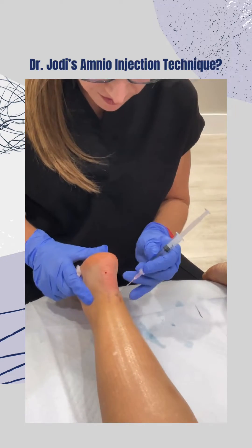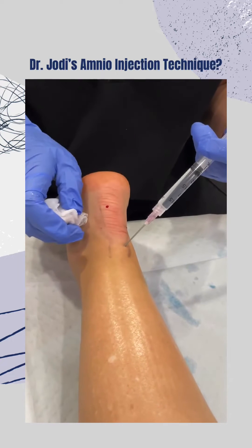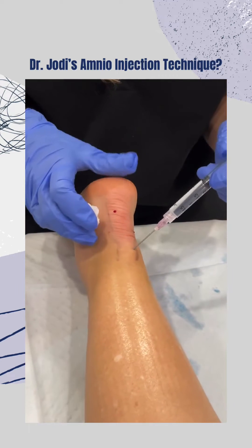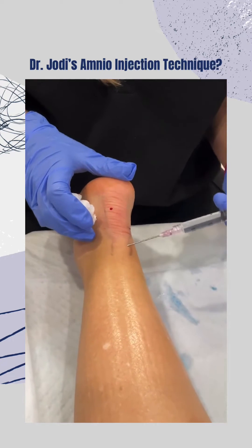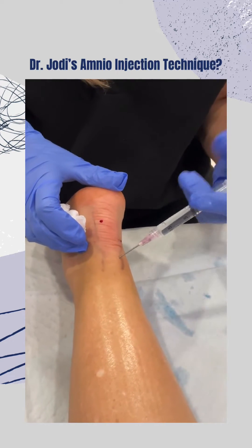I'm coming in, feeling a give of the tendon — now I'm in the tendon. Little injection. I'm going to come out, redirect, into the tendon, dropping.